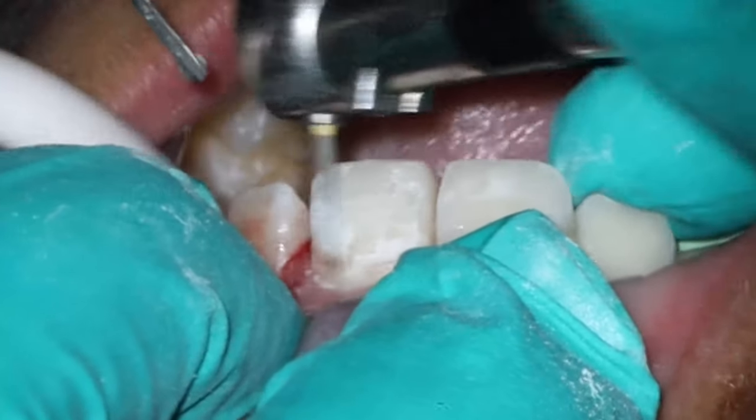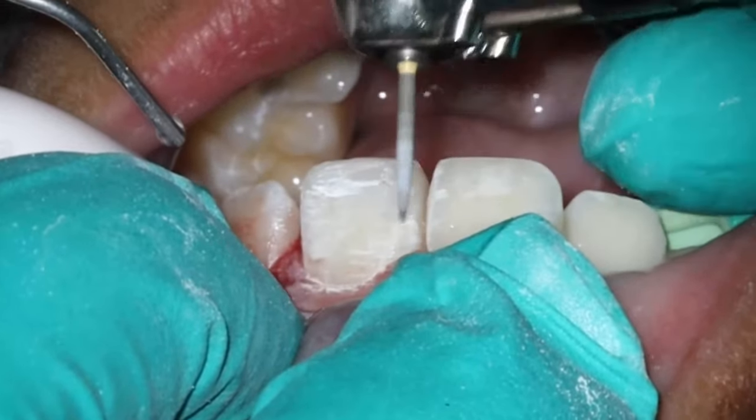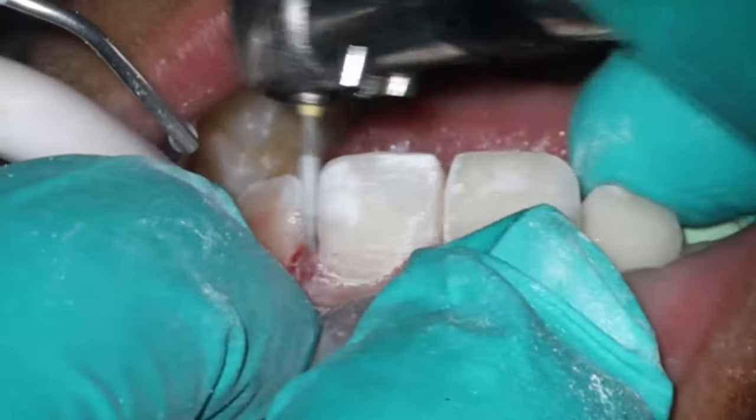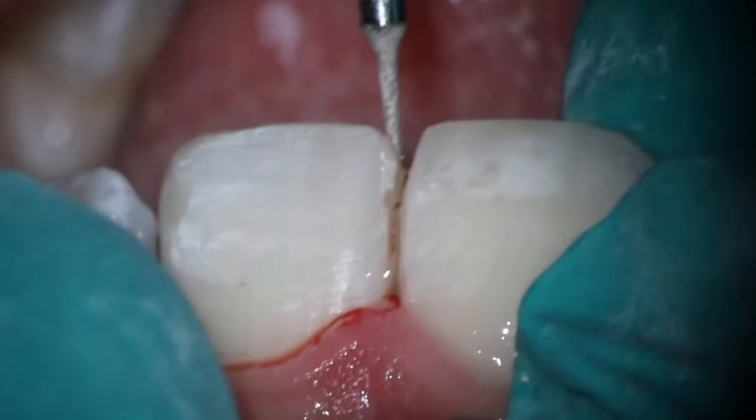And now we're finally going in with the polishing burr. I like using this flame burr to establish my line angles as well as just start to smooth off any of the rough spots. And you can see when you do this dry, the nice part is you can see exactly where the marks were from the previous one.